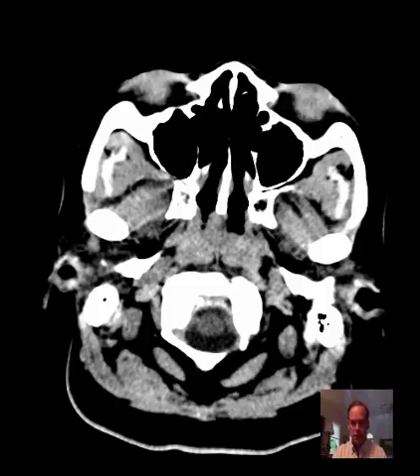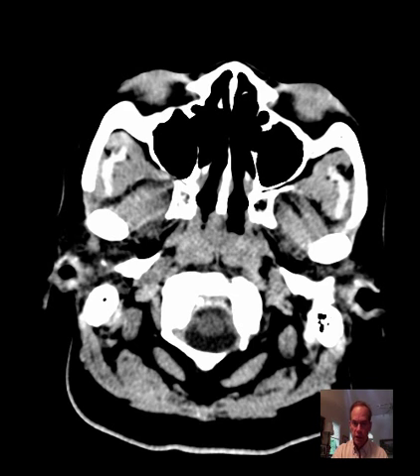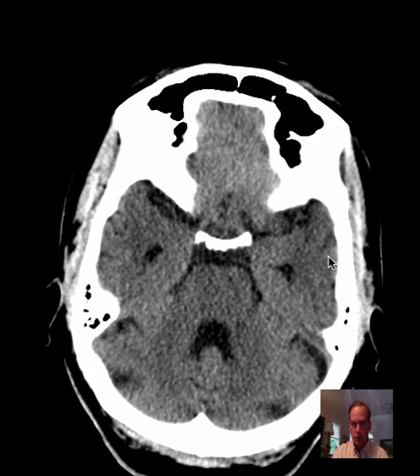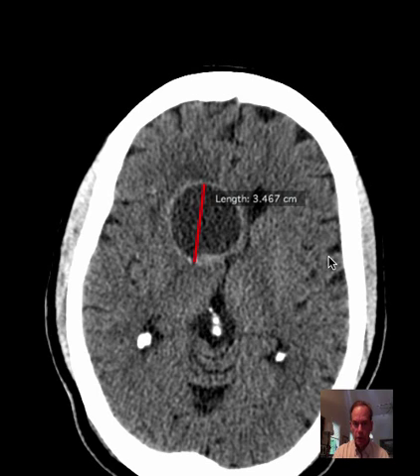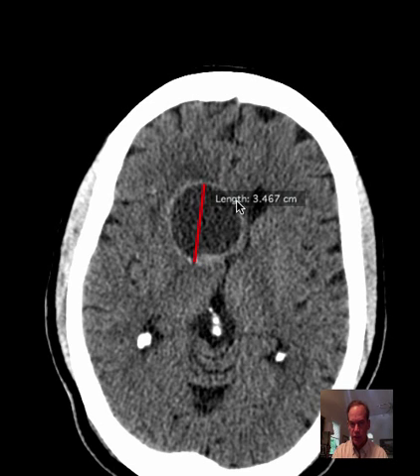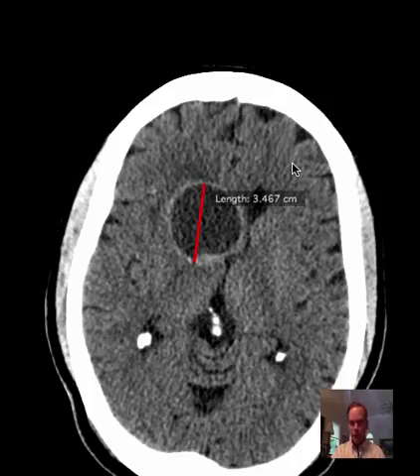Hello there, this is Dr. Mintz. This is a 63-year-old female who presented with headache. A CT head was performed. She had come to the emergency department and we found this lesion here — a 3.5 centimeter predominantly cystic lesion with a thin high attenuation perimeter.